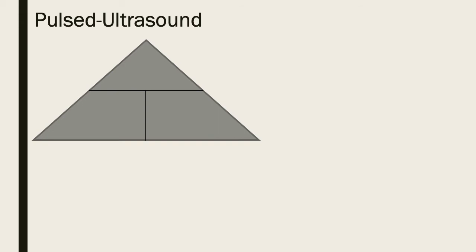But the question is why? Why does diagnostic ultrasound need to be pulsed ultrasound? It is really important that you understand there is a difference between pulsed and continuous wave ultrasound. So why can we not have continuous waves? Well, if we had continuous wave ultrasound, our machines actually wouldn't be able to create an image.